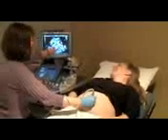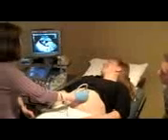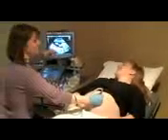In the first trimester, ultrasound is used to locate the pregnancy, see the number of fetuses, and where they are located, as well as to date and check the health of the fetus. In the second trimester, it is used to look at fetal structure, looking for evidence of birth defects, assessing for risk of chromosomal abnormality, and also confirming that the dates are correct. In the third trimester, ultrasound is most commonly used to check for fetal growth, monitor the fluid and health of the fetus, as well as to confirm the location and the function of the placenta.